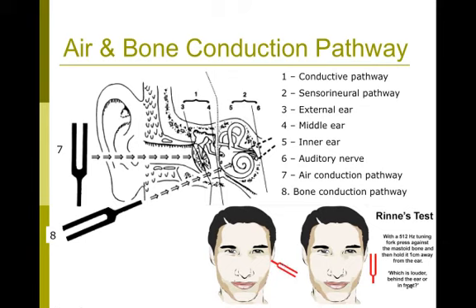Of course, with the advent of pure tone audiometry and audiologists in general, tuning forks are less commonly used because they might not provide us with accurate results. For one thing, the sounds that you get from tuning forks are not calibrated, and so the loudness is not calibrated, so you wouldn't be able to assess the degree, the severity of the hearing loss if the person can't hear.